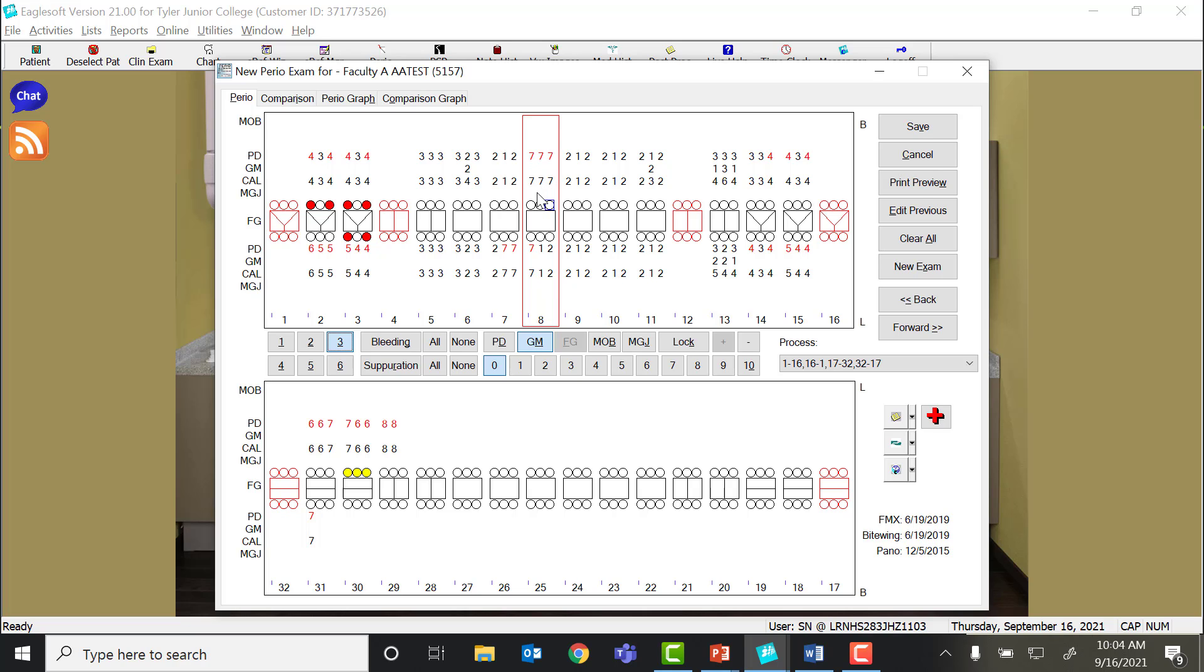We know, even by looking at the radiographs, the bone level here actually is pretty good. This patient does not have 7 millimeters of attachment loss. That gingival margin is well above the CEJ. So what you want to do is take your probe and gently slide down into the sulcus and feel where the CEJ is and take that measurement.